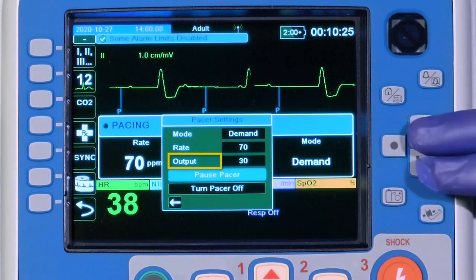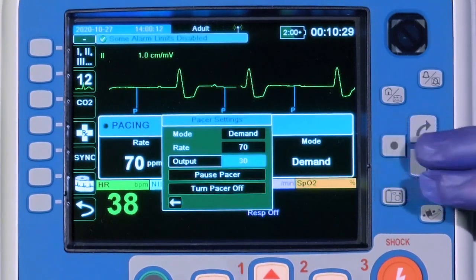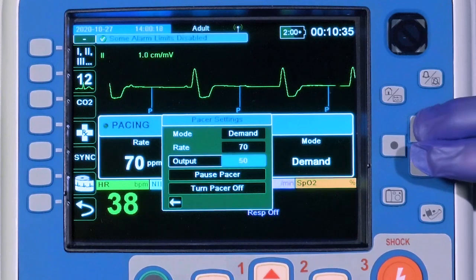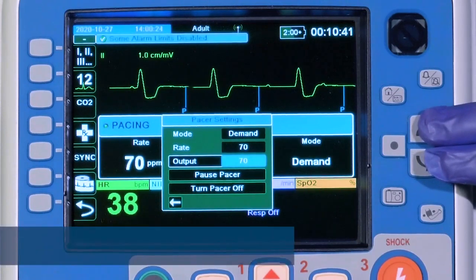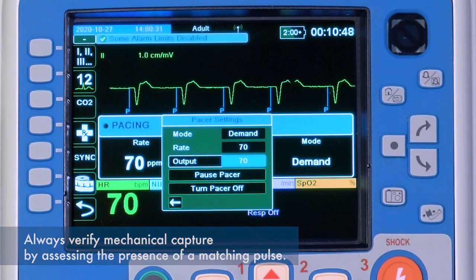Navigate to Output using the navigation keys to adjust the output. The output increases in increments of 10 milliamps and decreases in increments of 5 milliamps. Adjust the output in an upward manner until electrical capture is achieved. Note: always verify mechanical capture by assessing the presence of a matching pulse.